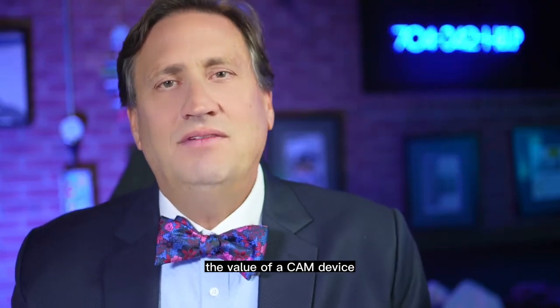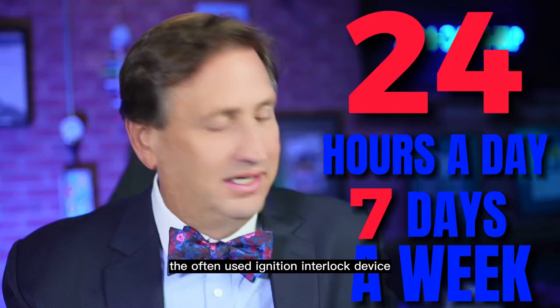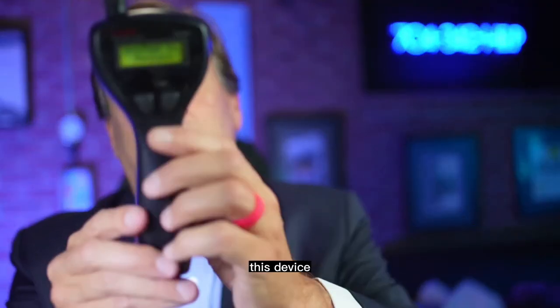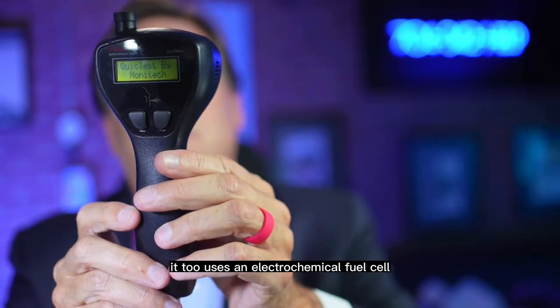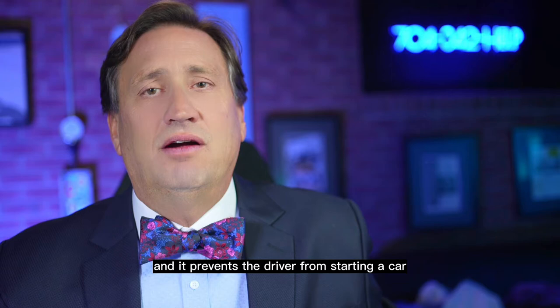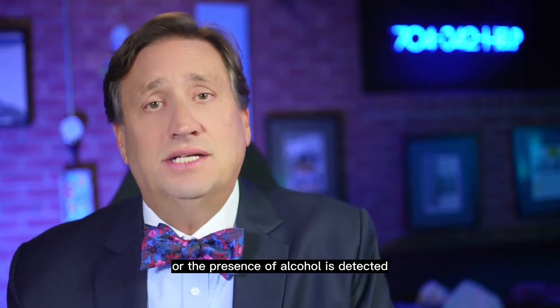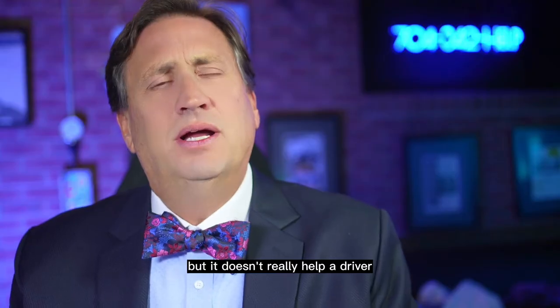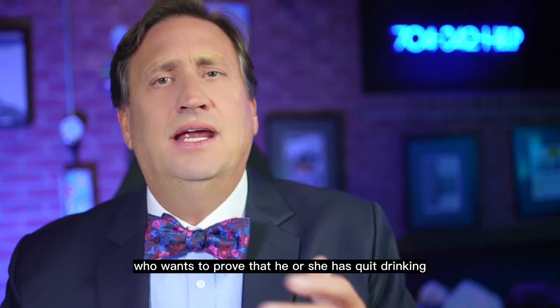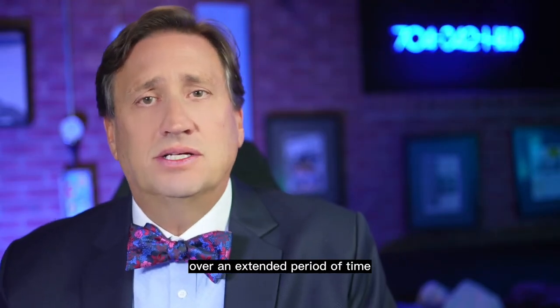The value of a CAM device is that it can be maintained 24 hours a day, seven days a week. The often-used ignition interlock device uses a similar technology — it also uses an electrochemical fuel cell, and it prevents the driver from starting a car based on a single breath and whether the presence of alcohol is detected. That's useful from a public safety standpoint, but it doesn't really help a driver who wants to prove that he or she has quit drinking or has completely abstained from drinking over an extended period of time.